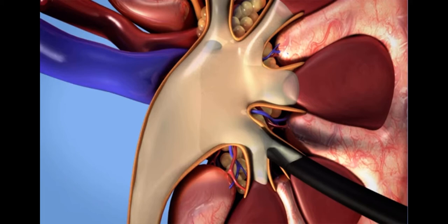In some patients, a temporary small tube, called a double J stent, may be placed to ensure that swelling does not block the drainage of the urine. The stent remains in place by J-shaped curls in both the kidney and bladder.